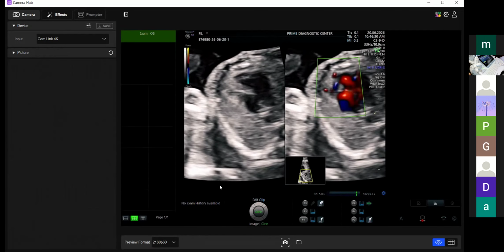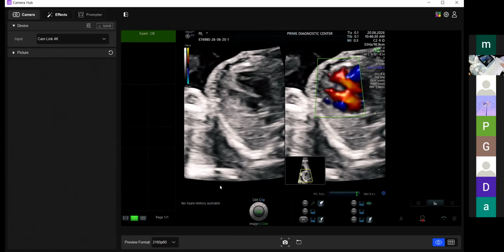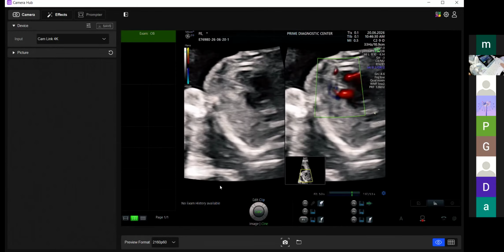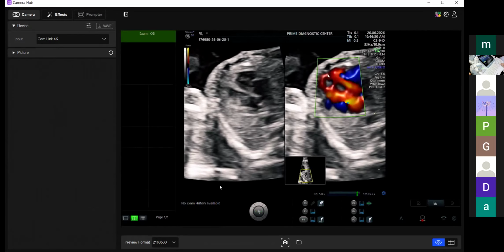And we hunted and it is there. I mean, we were expecting everything to be normal, and you see the bidirectional. You see some dropout here, and you see the VSD here, right? Done. The hunting has helped. And what this is on the side is not a VSD.